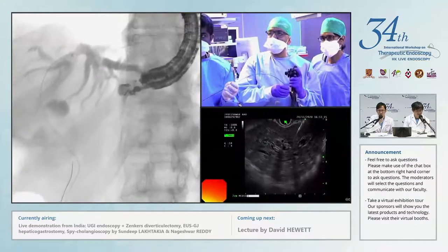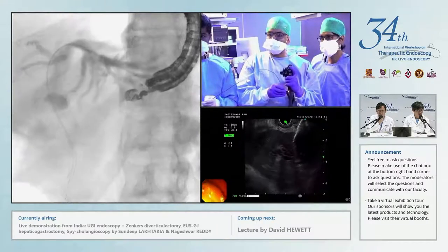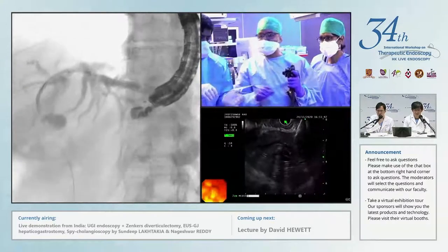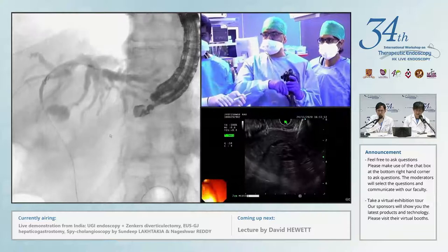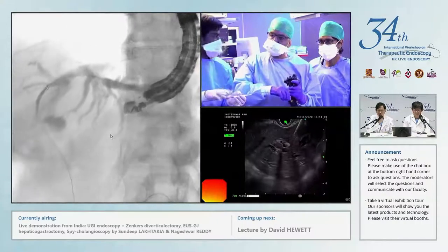Very nice stable wire configuration, that's right. That's most important, actually. My stent has gone in, and it's a 3:7. The distal 3 centimeters is uncovered, and the proximal 7 centimeters is fully covered. So I'll now start deploying and gently pull it back as well. Open, okay. Release.